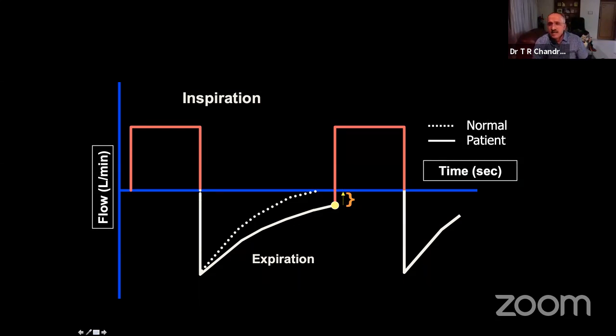But basically, the IE ratio can be increased. There is one case scenario Dr. Saneesh will discuss. Nebulization, suctioning, IE ratio, decrease in tidal volume, decrease in respiratory rate. These are the things you can do to reduce the auto-PEEP. Most probably, if there is a spasm, medical management is the mainstay. Then you can control the IE ratio if the patient is paralyzed. If the patient is not paralyzed and on pressure support, you have to change the expiratory sensitivity and the rise time. This is the summary.